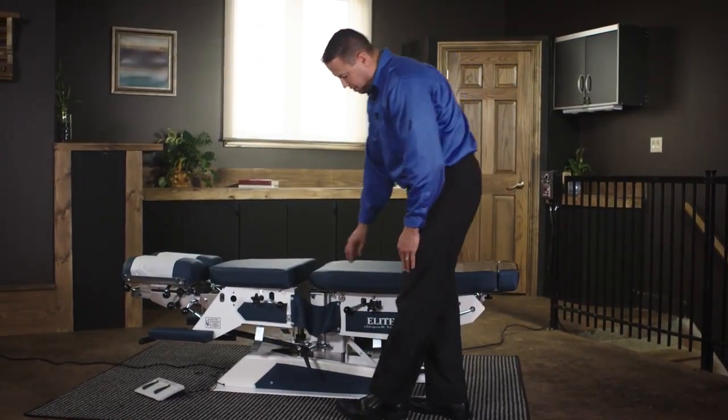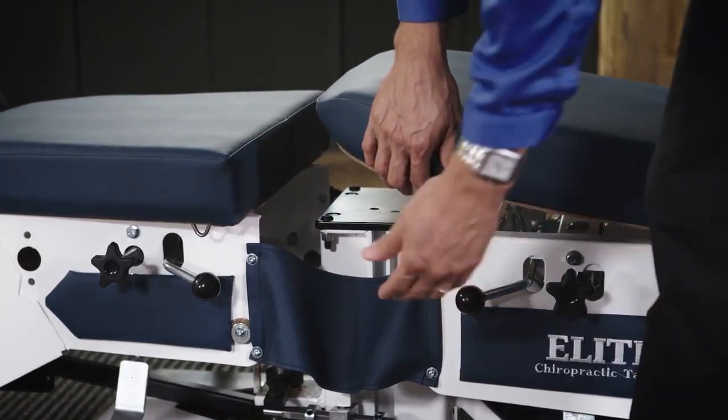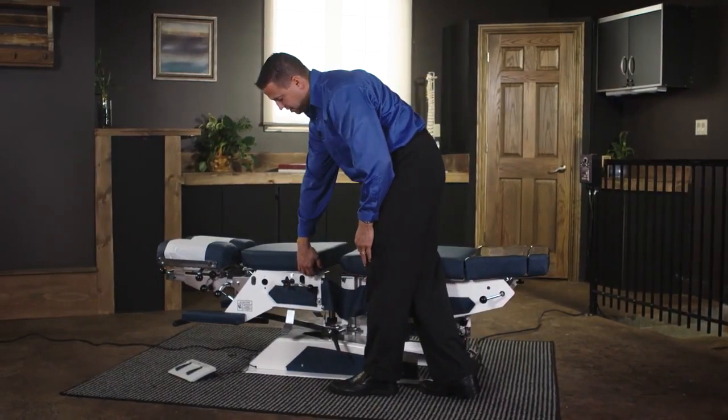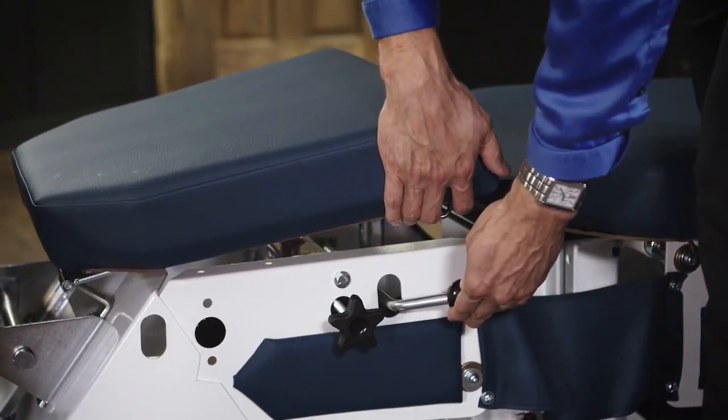The same thing happens in the lumbar area, where we will lift up on the cushion and lower down. In the thoracic area, the same thing — lifting and lowering.